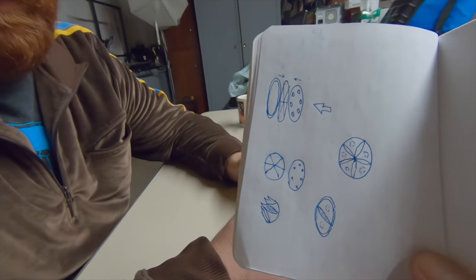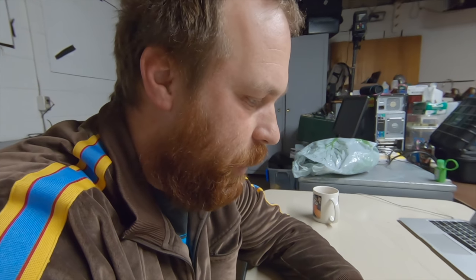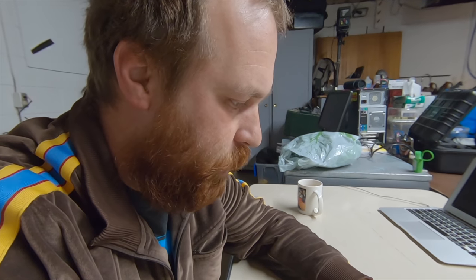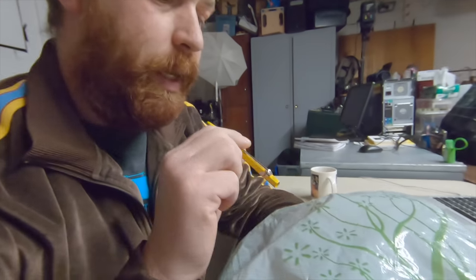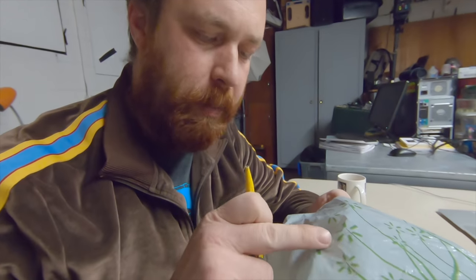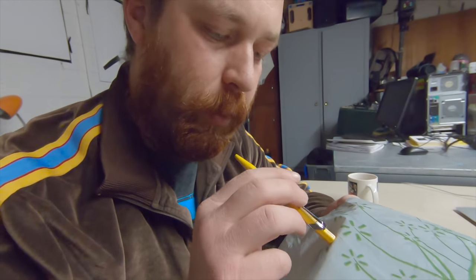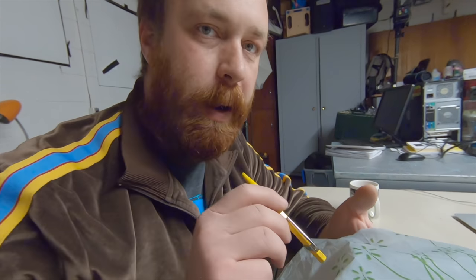So Ethan, I understand we're designing another valve. Yeah, it's your design, but I'm going to draw it in CAD. It looks like kind of a sand dollar. What did you say? It was based on a heart valve that you saw? Heart valve I saw in some documentary, yeah, flapper, kind of a diaphragm valve. Yeah, so the idea is, here, let's take a tube. If you have a membrane like this, and you suck, the membrane will close off the tube. But when you blow, the membrane will open up.